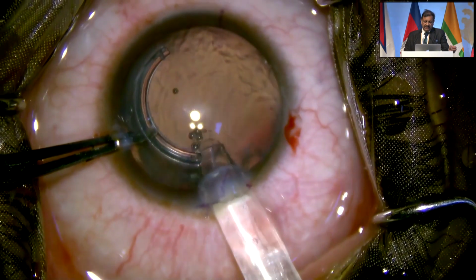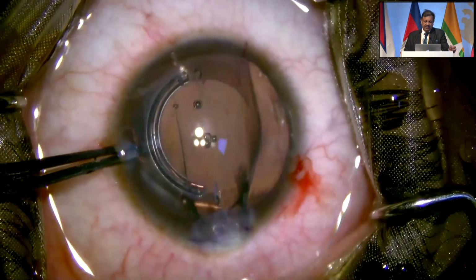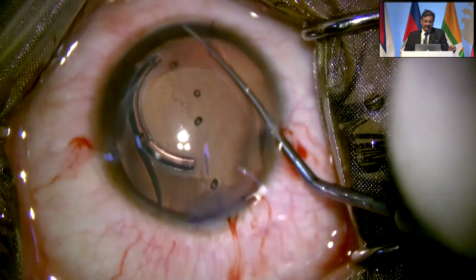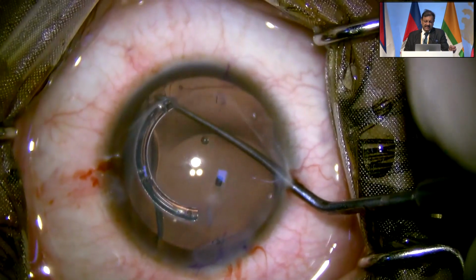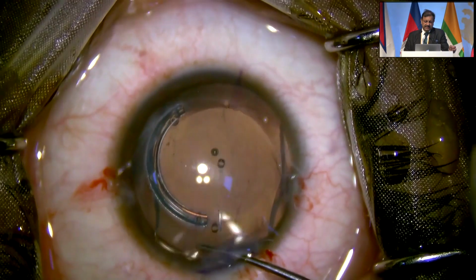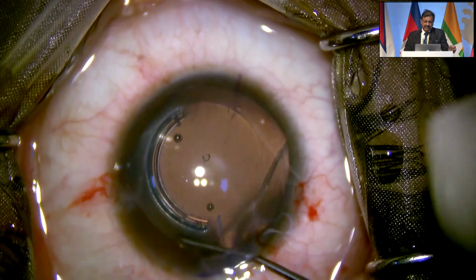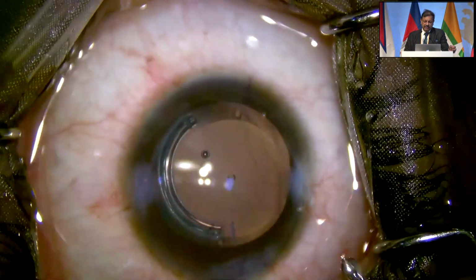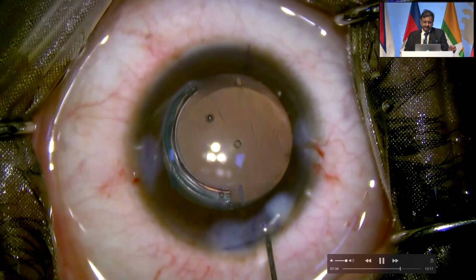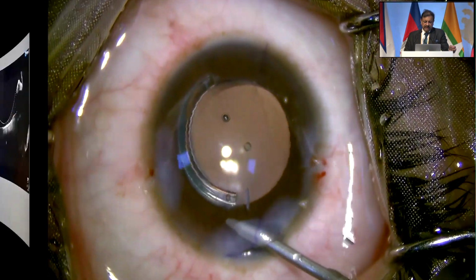Now this is a patient, keratoconus. We centralize the cone using Intax on the Smile Pro platform, and then we are taking the ICL inside the eye. It's a toric lens, and most of these patients, now it's not an off-label indication, but it's an indication for ICL in most of these toric patients. So right from low myopia.